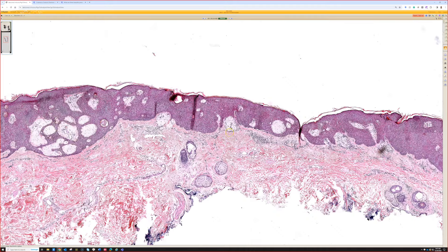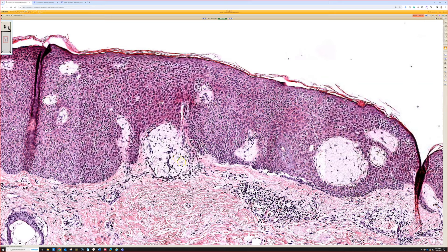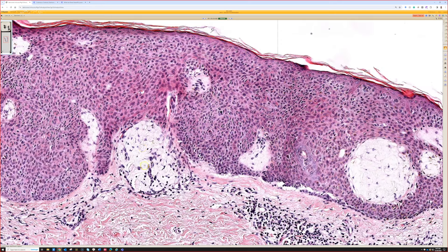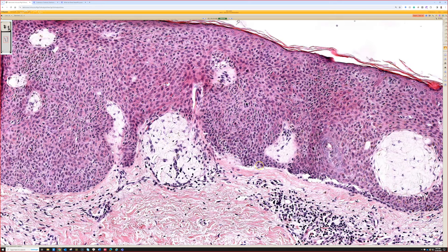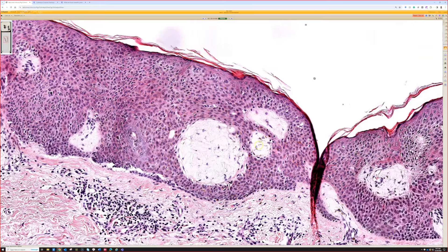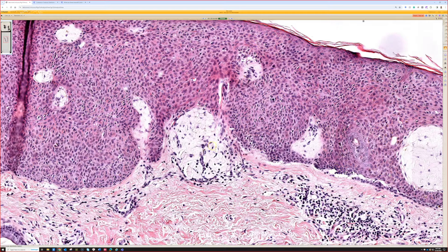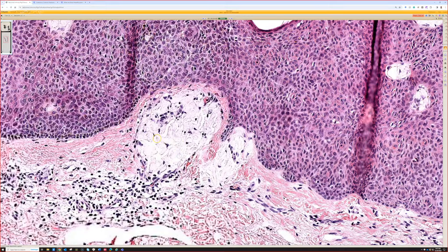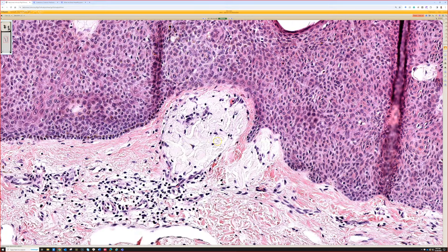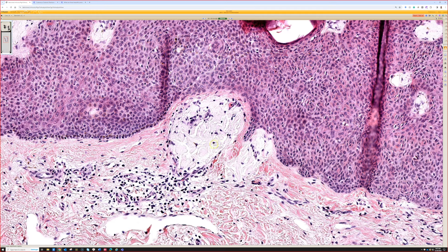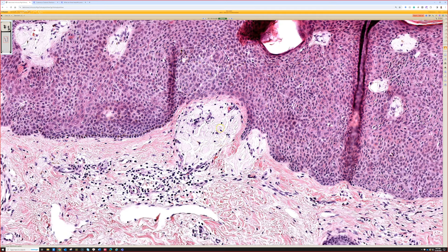There's a reason this case is included here: in addition to the seborrheic keratosis, there is homogenized pink material with cracks in it in the dermis directly beneath — right here, and right here. It's homogenous pale pink with crack artifact, and this is amyloid. It's similar to — a little bigger, but similar — to the amyloid we saw in the case of macular amyloid earlier.